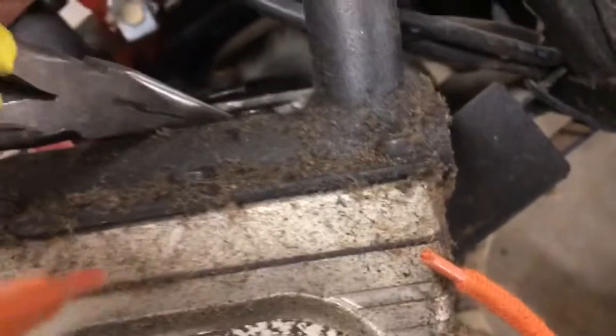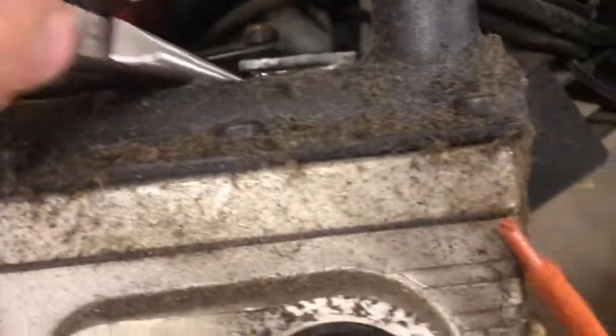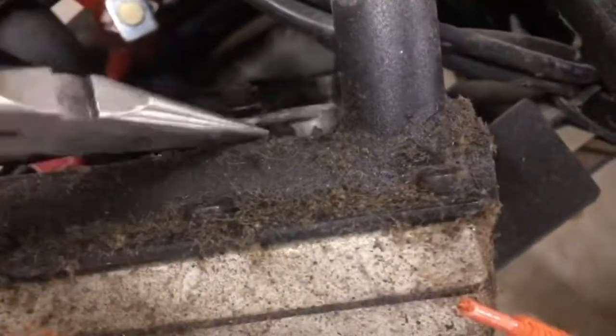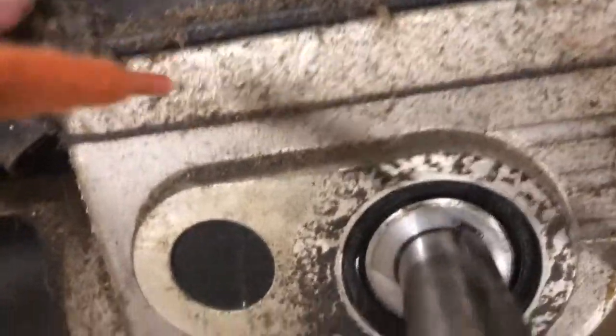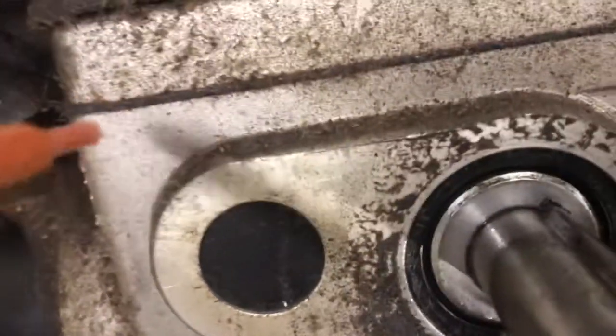If you do lose this, you can actually use other things. If you have some of those staples that they use in carpentry, the really big ones, you can use that and just wrap it around this, or whatever you have laying around, kind of hold this in place. Okay, eventually, okay, it fell out. It's down there somewhere.